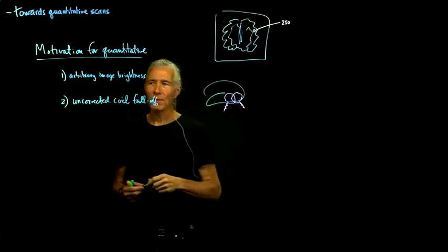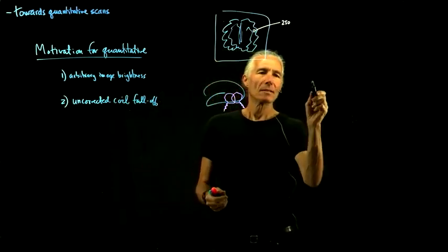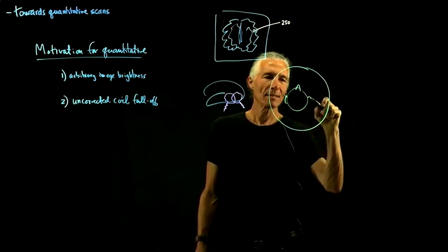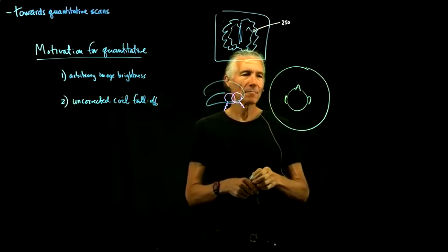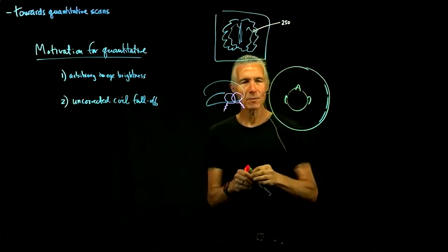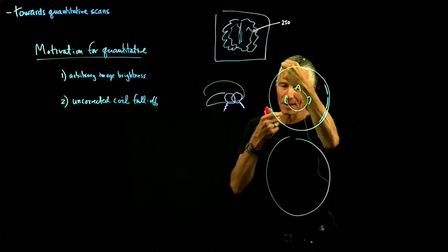And so what will that do? If you put somebody in the magnet, here's a cross section of somebody in the magnet. Say they're a relatively small person and they're centered in the magnet, and here you have the coils. Compare that to a situation where somebody, like me, has a very long head.